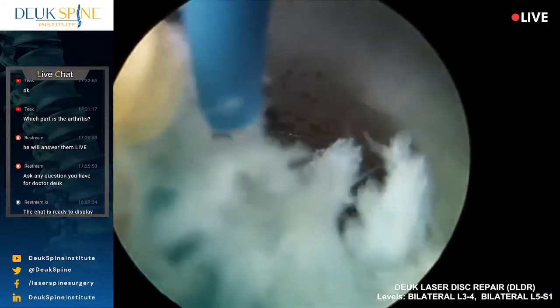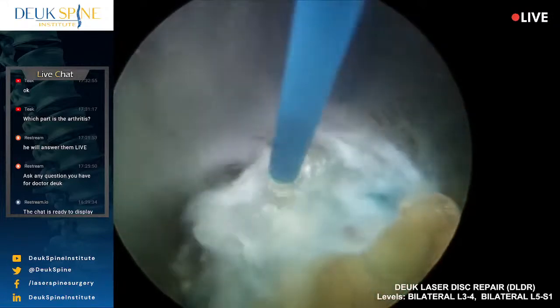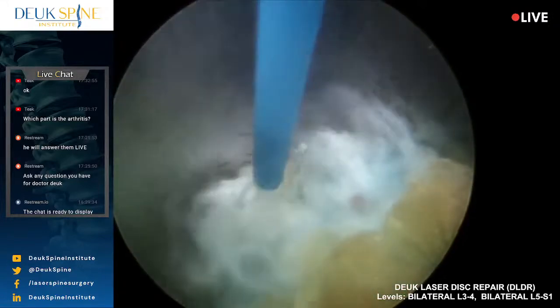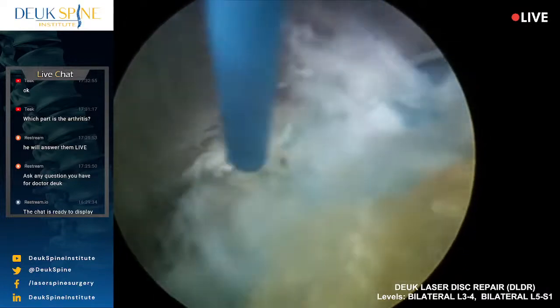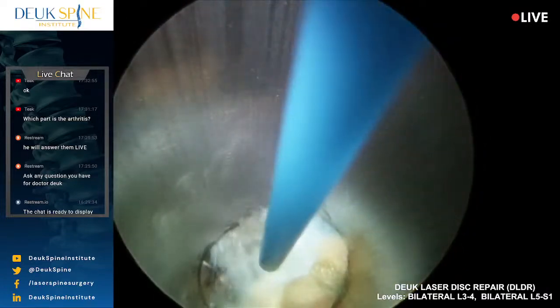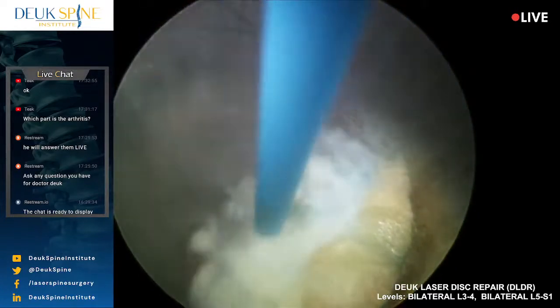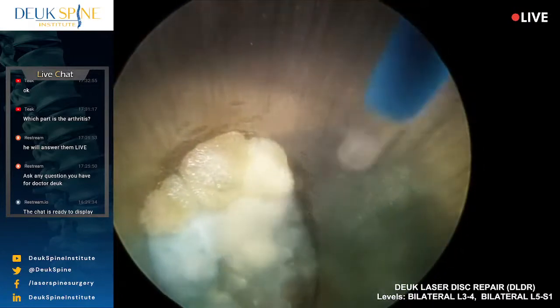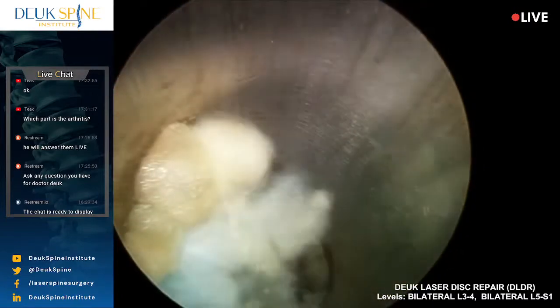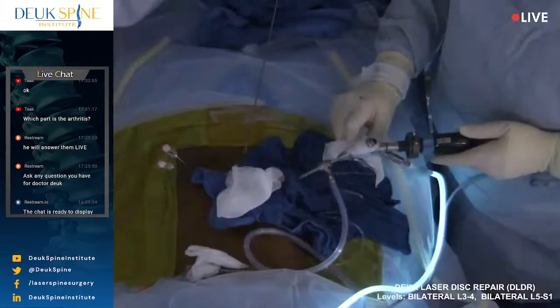So I'm just underneath the nerve root. I want to get just a little of the schmutz away. It's not compressing. Look at that herniation right there, a piece of herniation. It's not really compressing the root, but I do want to get rid of it because it'll let it heal better. That's all just fat right there. We're done. Lights on, scope off, please. Thank you.